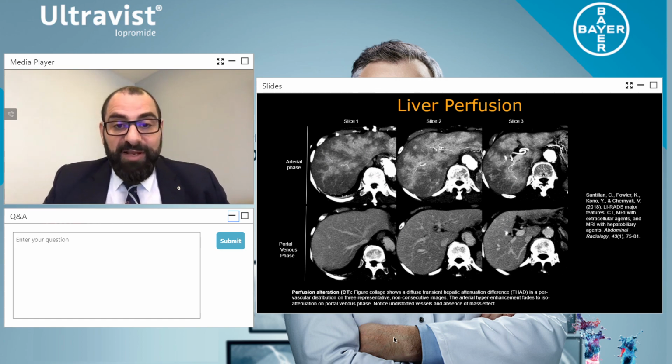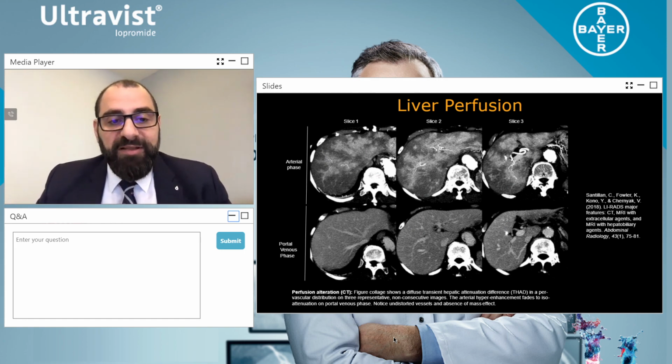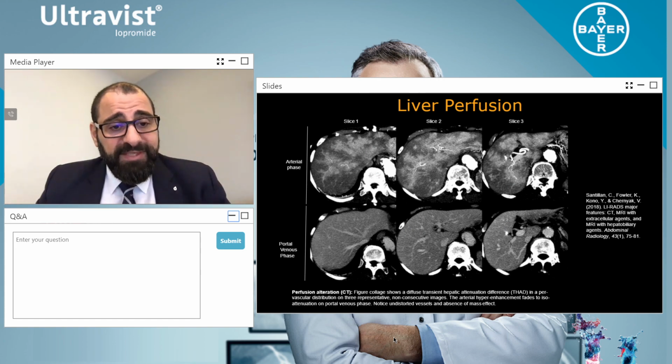So normally in the arterial phase, if you look at the top line here, you see that, oh my goodness, this looks like there's a lot of lesions within the liver. But in actual fact, you actually had to do a venous phase scan unnecessarily, and it showed there was no perfusion deficit. This is because your patient is dehydrated, they've used a dimer as a contrast, and also, and this was a paper that was published in LIRADS, and also we never used saline to keep the contrast pushing through.